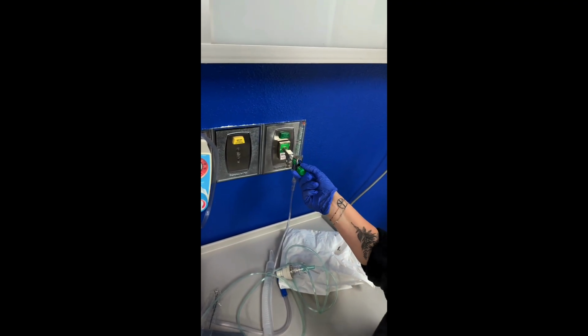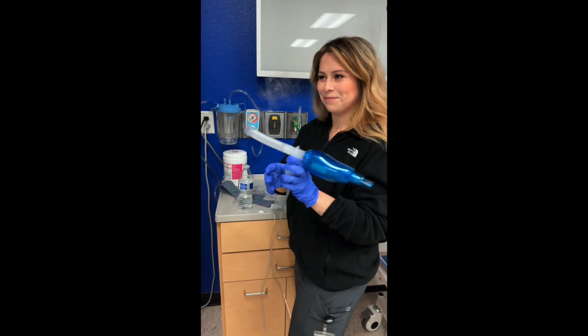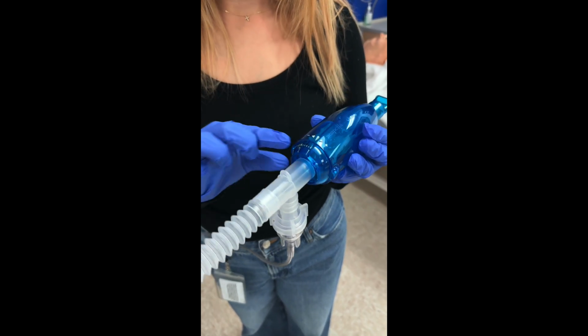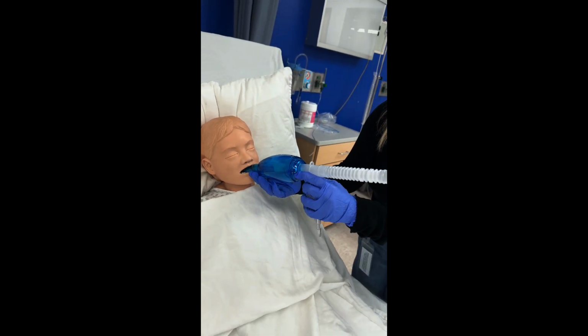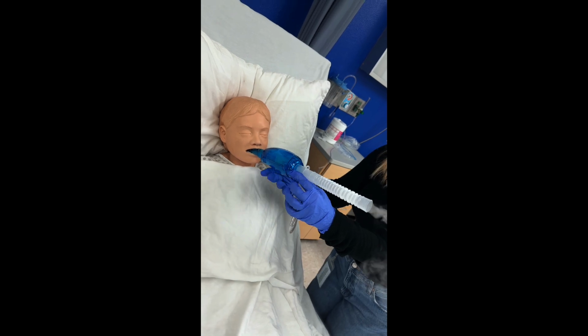I adjust the Acapella resistance dial, starting at a lower setting and increasing it until the patient can maintain a slow, controlled exhalation lasting approximately 3 to 4 seconds with noticeable vibration. Once aerosol production and resistance are confirmed, the device is ready for patient use.